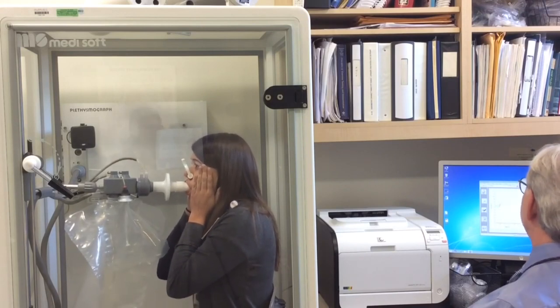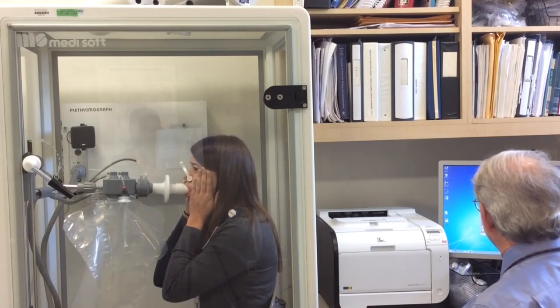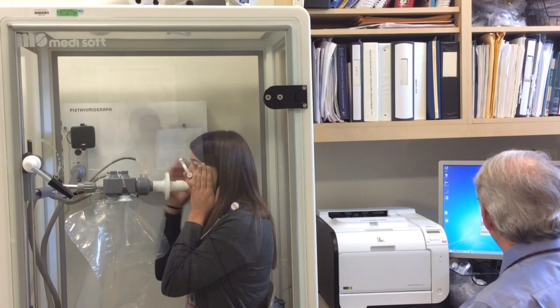Deep breath all the way in, Danielle. And then blow it out. Squeeze it out hard. Go, go, go. Big breath in at the end, please. Nice. Good job.